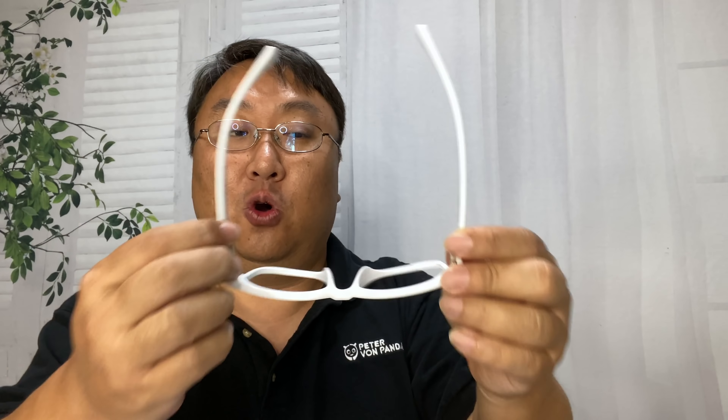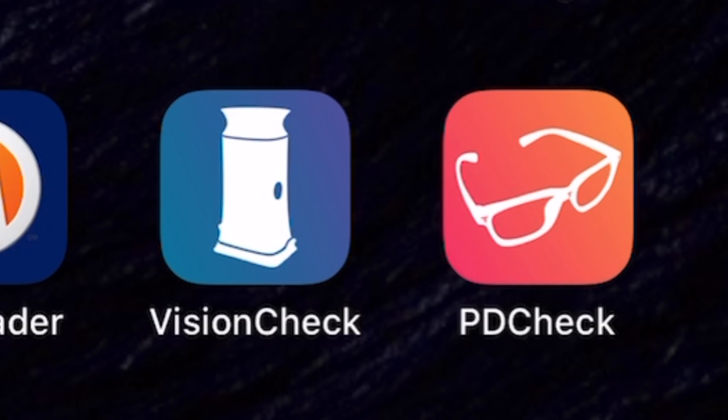You get a plastic set of frames, and they come with a code printed on the inside arm, which is what you're going to need. You'll download the PD app from EyeQue, log in, put on these glasses. You can see the T's that are on the glasses — these are known distances — and so you're going to use the app to basically take a selfie while well lit.